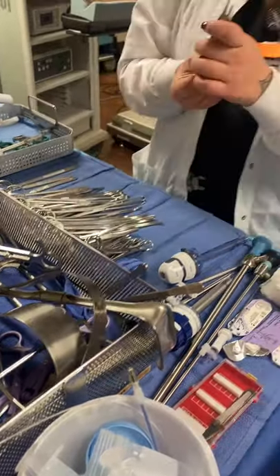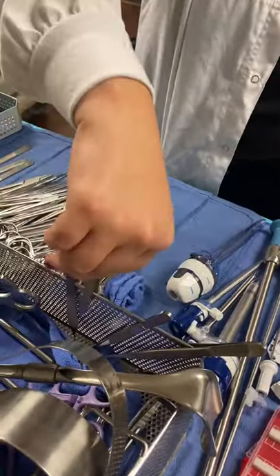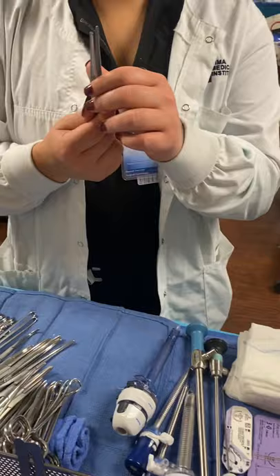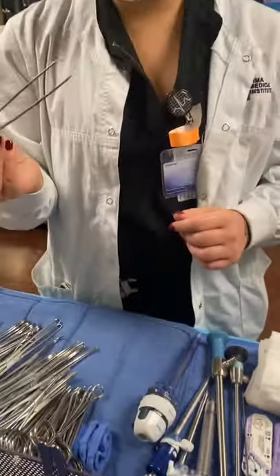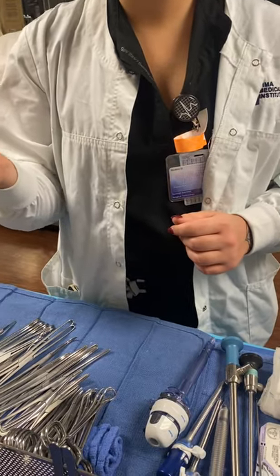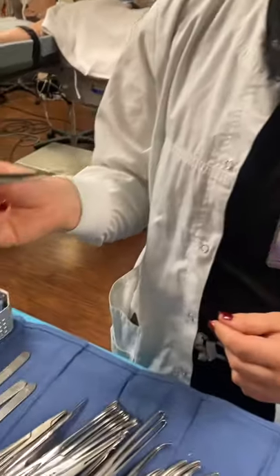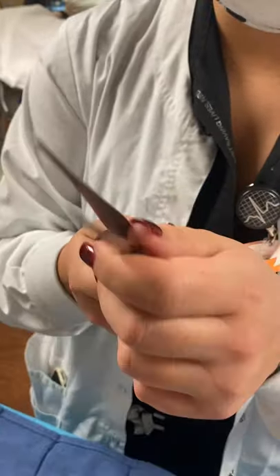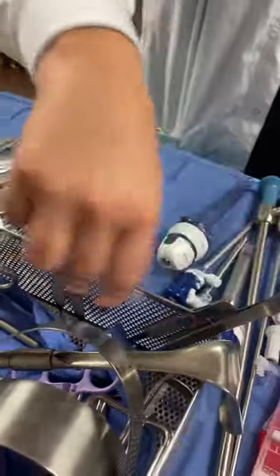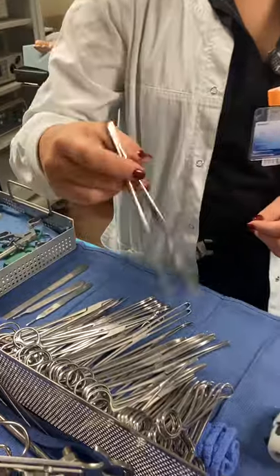And then Adson with teeth, one, two. Adson with teeth, two. Rat tooth, one. Rat tooth, one. DeBakey, one. DeBakey, one. So it has the striations — that's how you can tell, the grooves. If you look on the tip, there's two grooves on one side and one on the other. That's going to be the tip of every DeBakey. DeBakey, one. DeBakey, one. And then Russian, one. Russian, one.